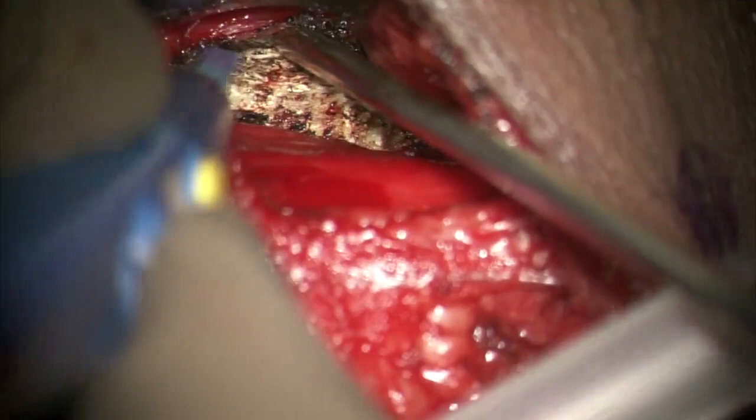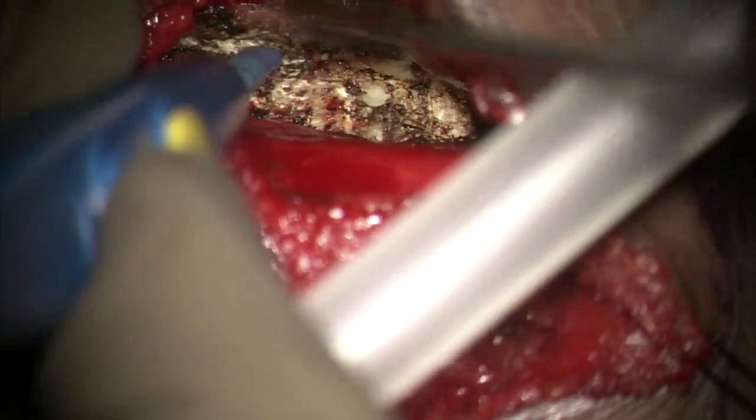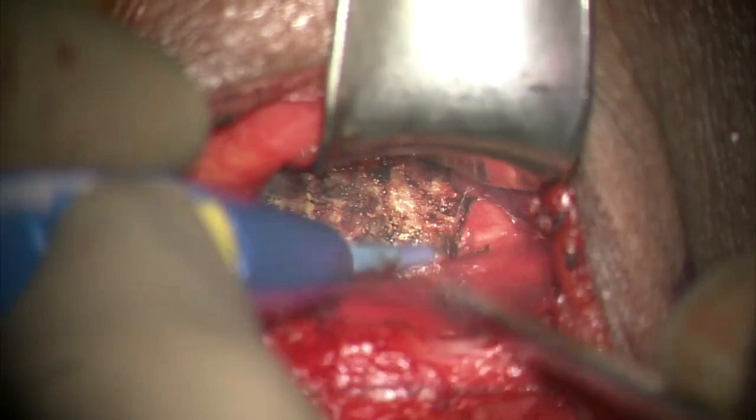The vertebral artery is unprotected at the level of the disc as it does not lie in the bony neuroforamina, and extensive lateral dissection can endanger it. There are no blood vessels over the disc, but bleeding can be encountered from nutrient foramina that are usually located at the mid-body level.